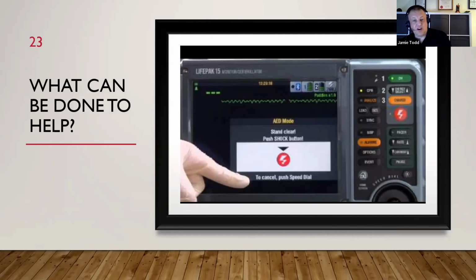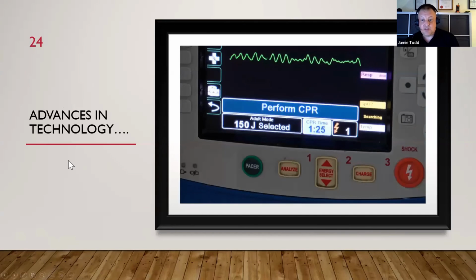You couldn't deny that it was helping, because every time I put up a shockable rhythm, of all different types, because I'll scroll through and find the different variances of VF that I can, the machine every time would just go, yeah, I'm going to shock that. So I think that possibly does have a place, along with managing some of the educational issues. Technology may be an answer.